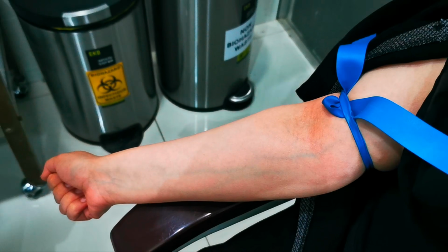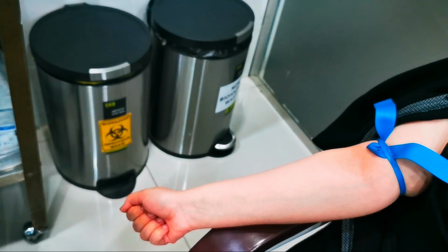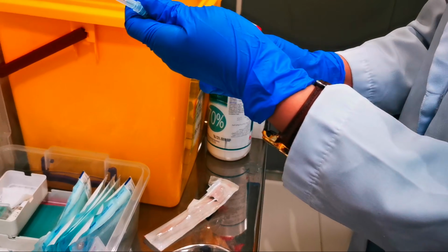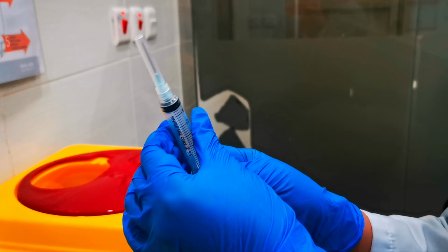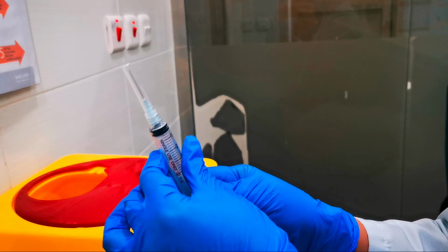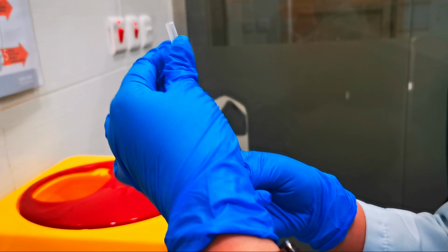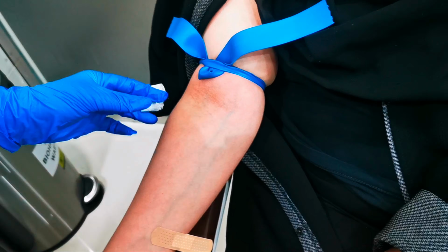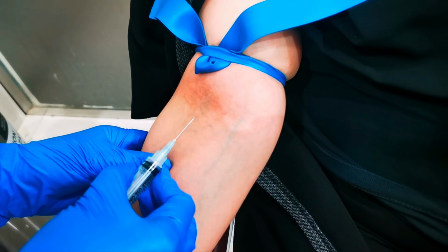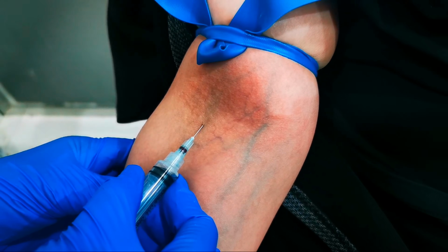Then while waiting for it to air dry, we will inspect the needle for burrs, bends, and if there's air that is introduced to the needle. Pull and push the plunger and make sure that there is no air inside the syringe. And now I am ready to insert the needle while anchoring the skin.